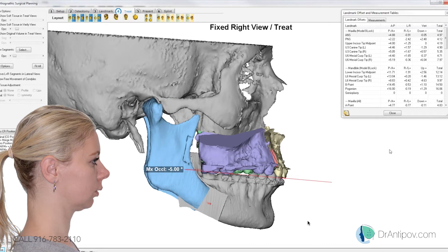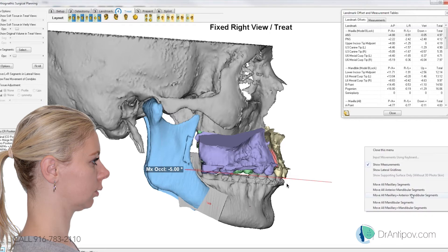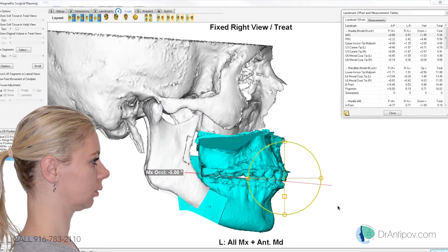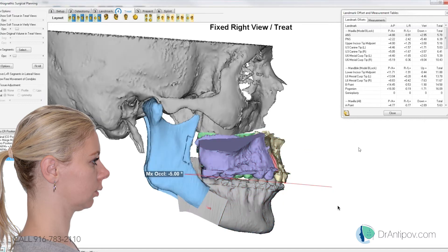Did you want to keep the vertical position of the incisal edge the same? No, we'll drop it about 3 millimeters — actually, let's do 3. So if we drop that anterior 3, you're now bringing your right molar down about 9. You want to keep that right molar to only coming down 6? I think she looks pretty good like this.